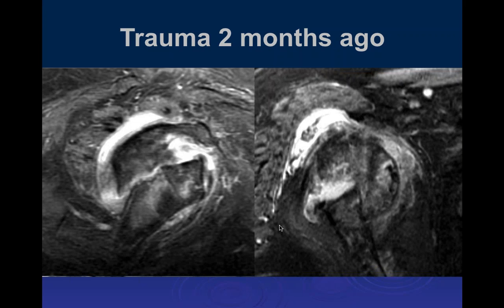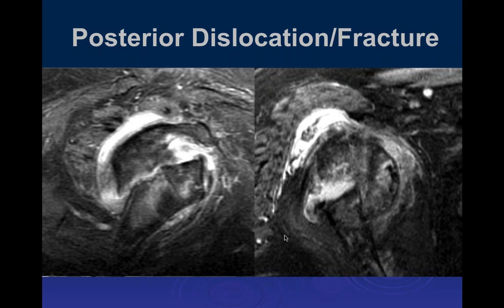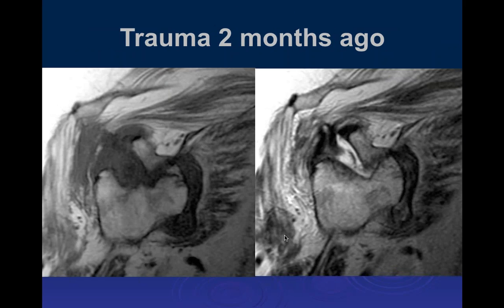I don't know if these are coronal or axial images. This is axial and this is sagittal. Oh, okay. So basically, what we're seeing here is a comminuted fracture of the head with dislocation. So it's interesting that this trauma was 2 months ago and they're just now coming to get imaging.